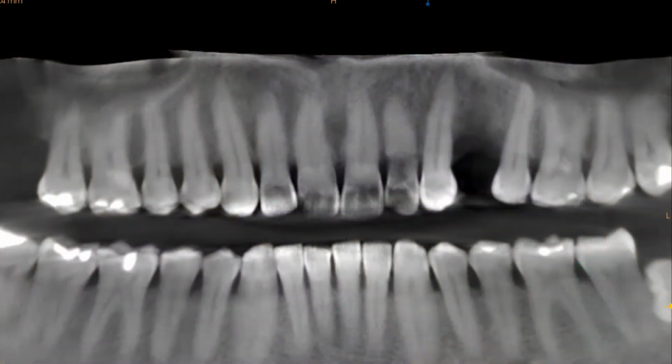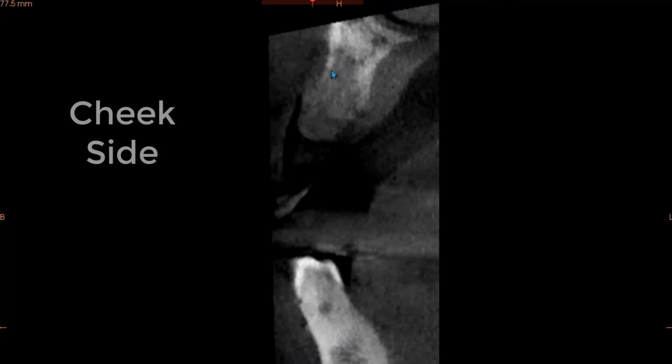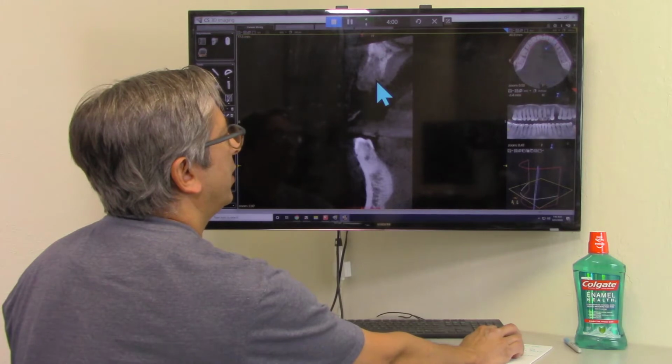Let me move the marker over, and we're going to move it to this site here. That's going to be our implant site, and we can see here the tooth where it once was, and it's fairly porous. There's not a lot of bone going on here, and you can see a little thin feather of a facial plate that was once there, meaning that this is the cheek side, this is the bone side, and then here's the socket site, and you can see there's really nothing there. This is actually tissue, so the density you're seeing here is tissue, which means there's really no bone here. It's mostly tissue, with very little bone, and it's also very low. You can see it in a dissolved manner, and there's really not a lot of bone there.